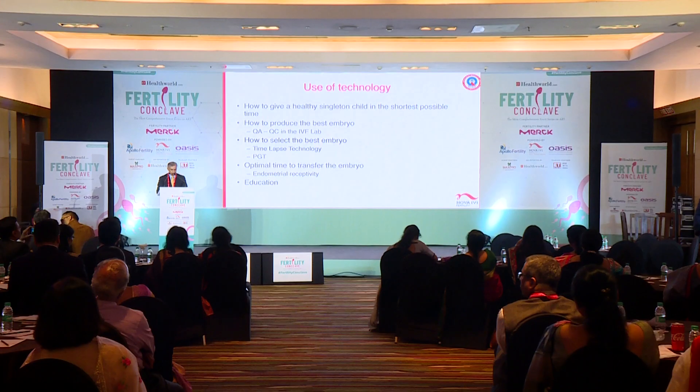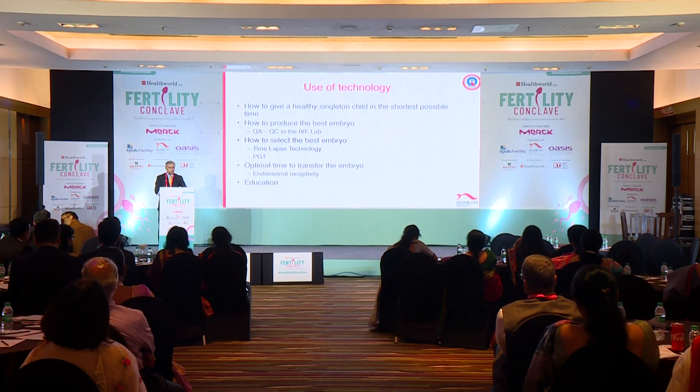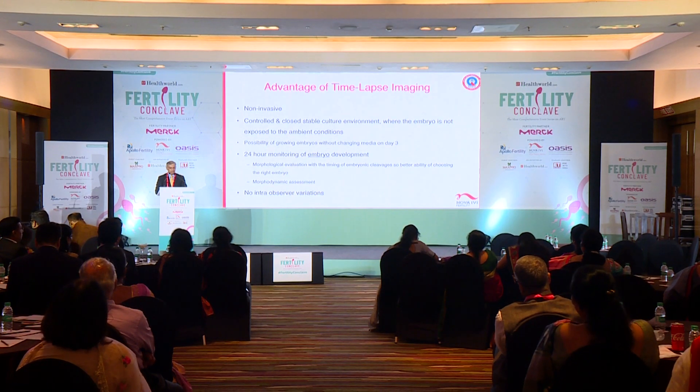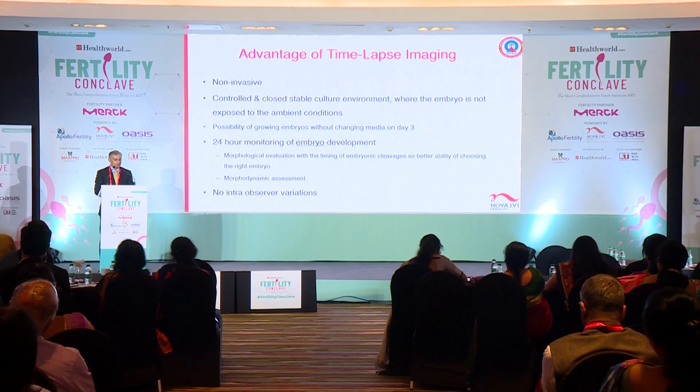The second area where this technology has been used is to select the best quality embryo. Let me take you through the time-lapse technology and how we use it. Conventionally, an embryo is graded by removing it from the incubator at a fixed time post egg retrieval. In time-lapse, the embryos remain in the incubator but are photographed at periodic intervals so that you do not need to remove them to assess how they are growing. It is completely non-invasive with controlled and stable culture conditions, allowing 24-hour monitoring.